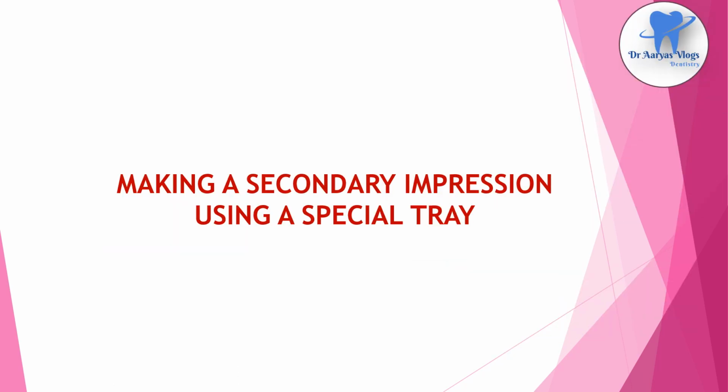Then making a secondary impression using a special tray or custom tray. It is the most commonly used method for making the master impression. And this technique varies for both maxilla and mandible. But for both the impressions, the custom tray is fabricated with a spacer as described in the previous video.